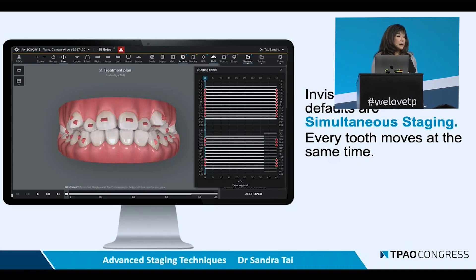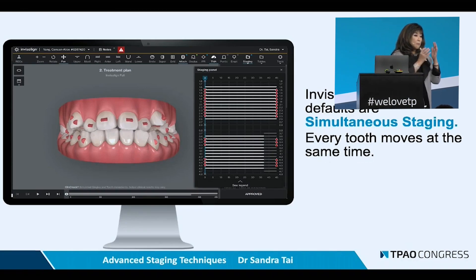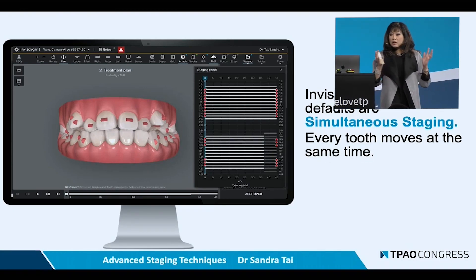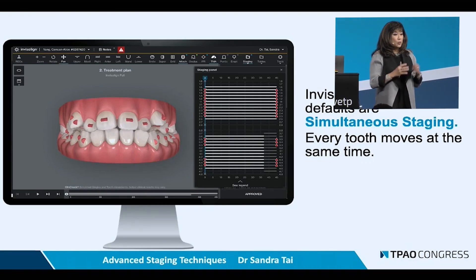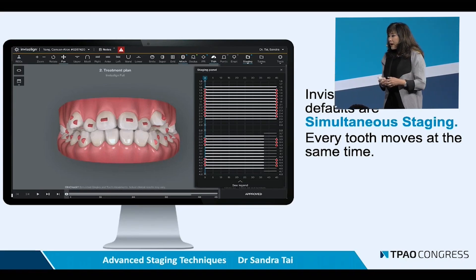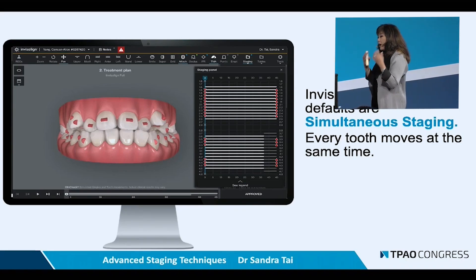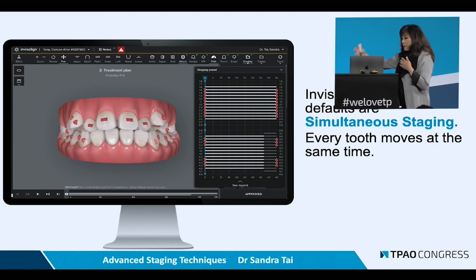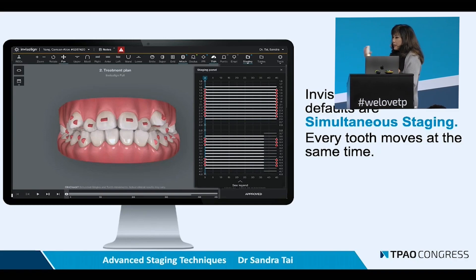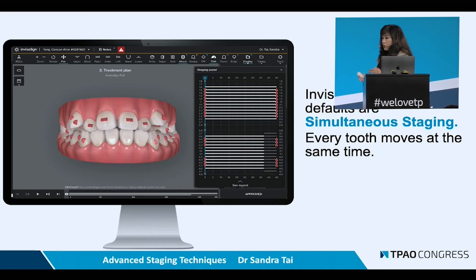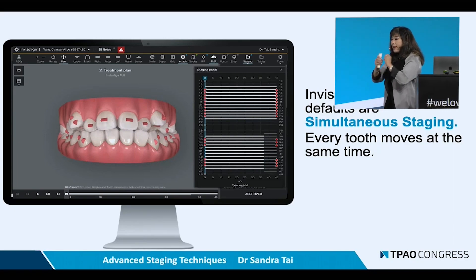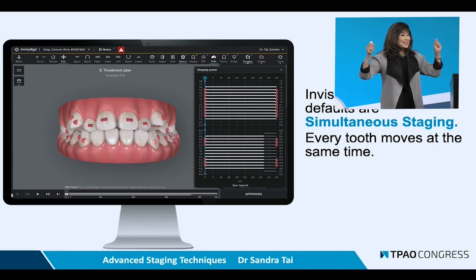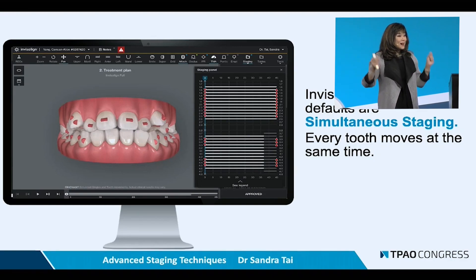The Invisalign system, and I would say many of the other systems we are talking about, whether it's Spark or ClearCorrect, use simultaneous staging. So in the digital software plan, every tooth is going to move at the same time.